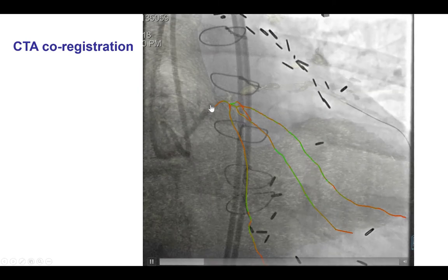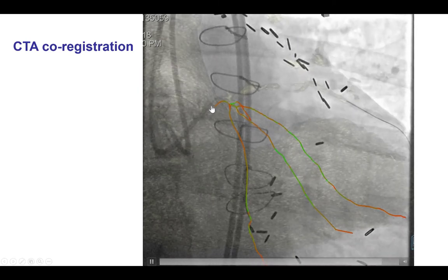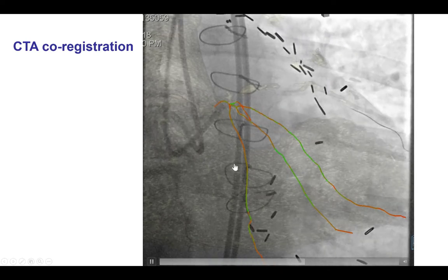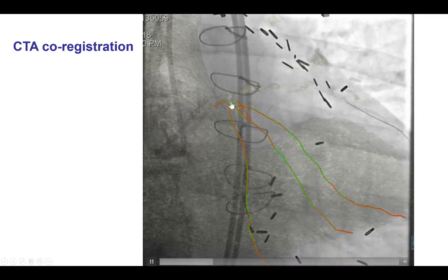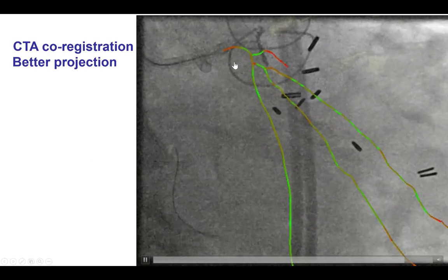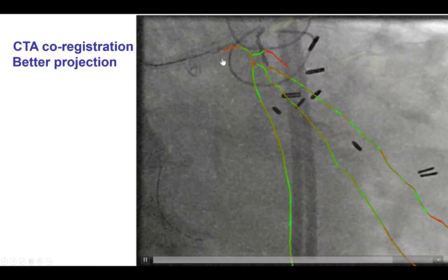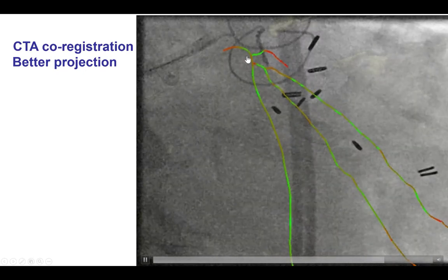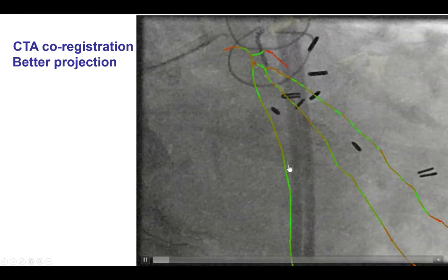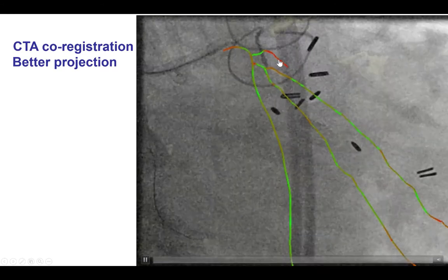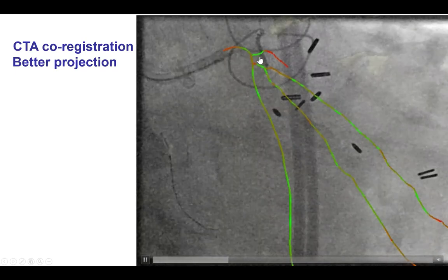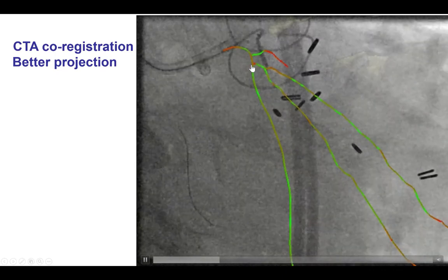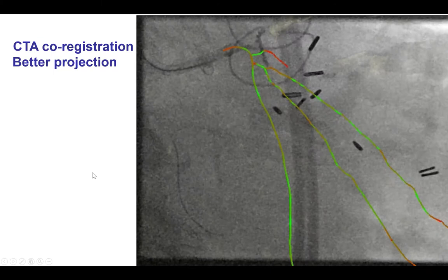We registered the angiogram and the CTA, which can be very useful allowing us to determine the vessel course. In this particular case we see that the circumflex is heading down and the Ramus is a large bifurcating branch. Once we changed the projection and went more caudal, we could see better what the problem was. In this particular view we have the least foreshortening — the green means minimal foreshortening whereas red means significant foreshortening. It becomes apparent that the problem we had with crossing is that the guidewires entered a small branch before the occluded segment, which is why we couldn't cross into the distal circumflex.